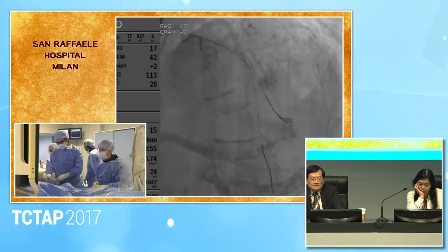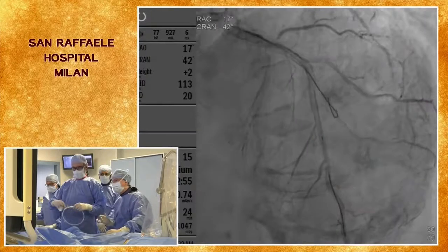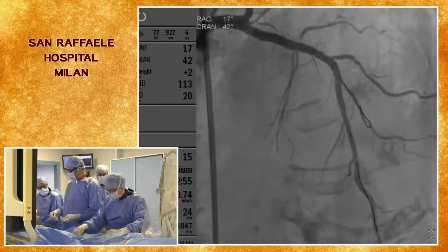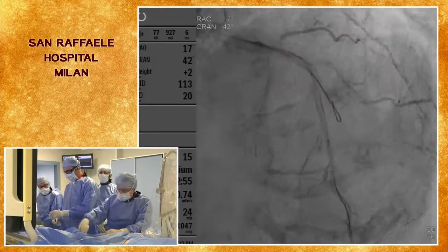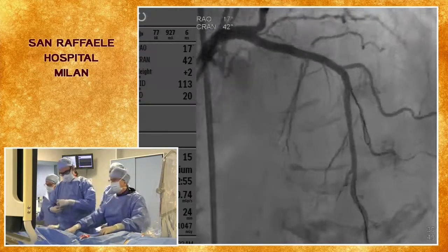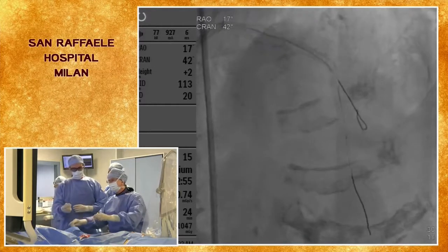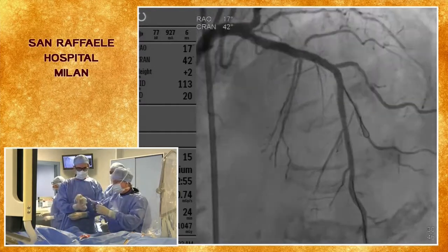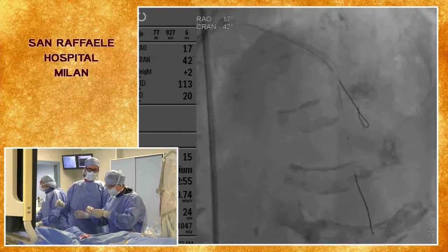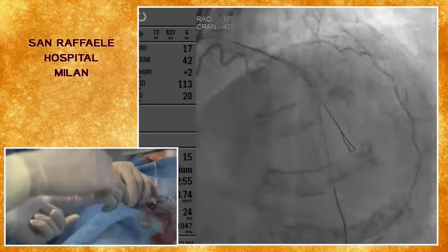Okay, we still have 8 minutes, but our strategy now to summarize will be to do an IVUS and decide how much we need to post dilate. Most probably we will post dilate for sure, proximally, and most probably even distally with a 2.5 non-compliant balloon. You did post dilate, with a 3.0 distally and a 3.5 proximally. Oh, you already post dilated. Yeah, just before you came, so maybe it's okay, let's see.